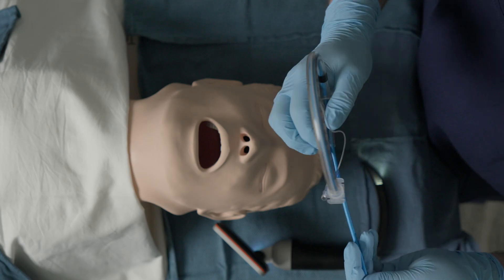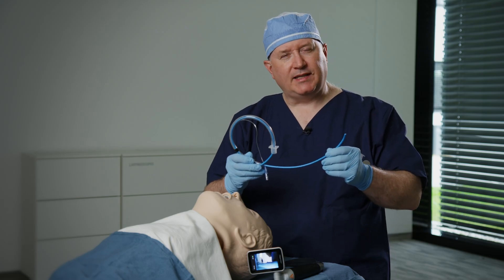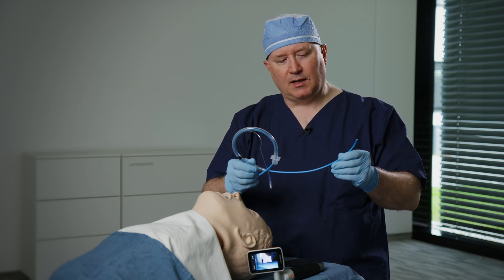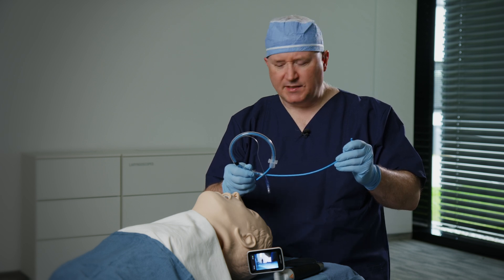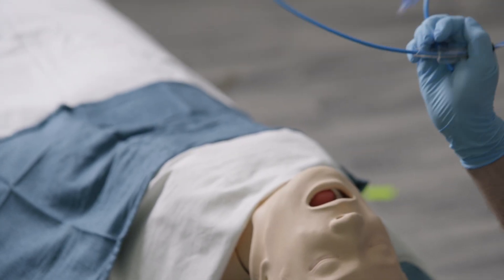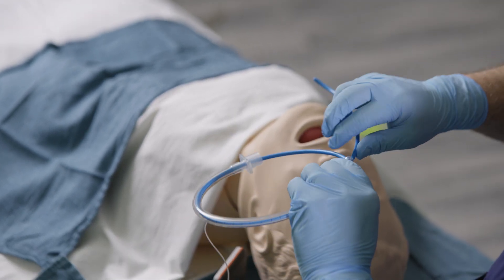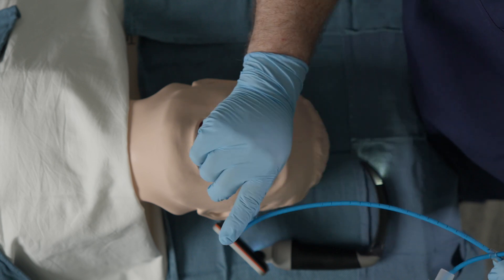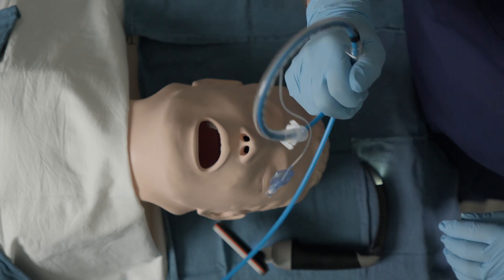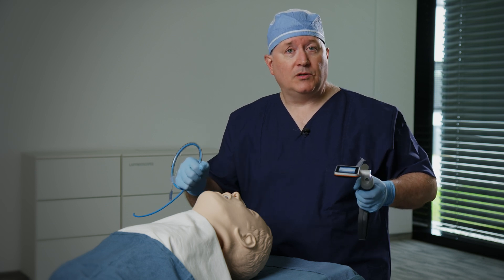We're going to discuss using a preloaded bougie technique in order to perform the intubation. This is a technique that has been called the Kiwi D. It's a procedure that allows a single practitioner much more latitude and less need for an assistant. What we've done, which is different from the Kiwi grip — the Kiwi grip is where we hold the tail of the bougie ourselves — is we're utilizing the existence of the murphy eye to hold a loop in the tracheal tube which exposes the business end, the usable end of the bougie, while I can manipulate the tip in many different directions. It also frees up my hands for the process of using suction or doing other procedures.